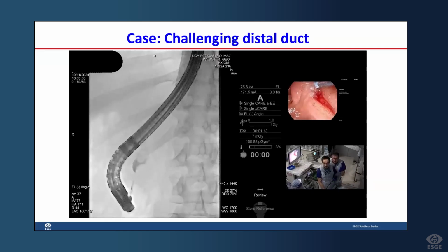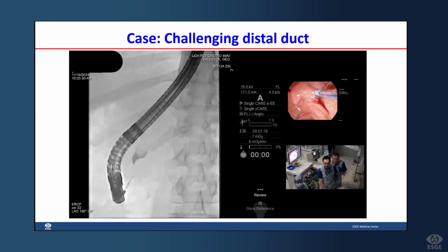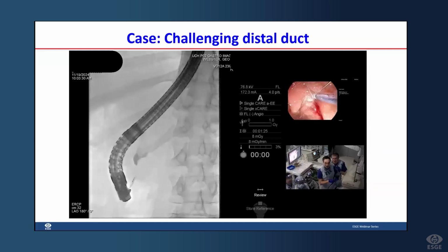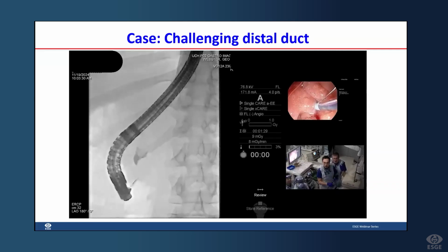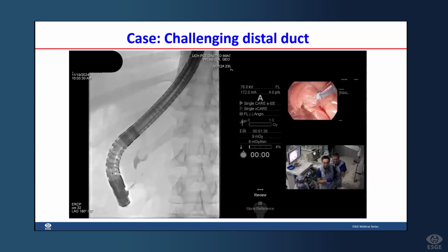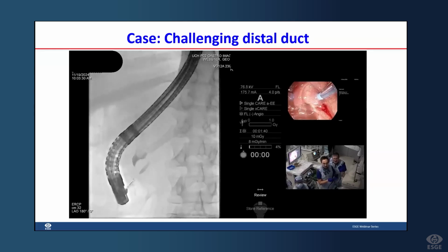So you need to shorten your scope and maybe thumb up and straighten your scope out. Screen, please. Very nice. Now you can try your wire. Nope, stop. It's going to push you out. Okay, now you need to take the bend off the sphincterotomy and shorten your scope more. Stop there. Now put a bit of contrast in. Now you're filling the PD. Isn't that interesting? So, okay, stop there.